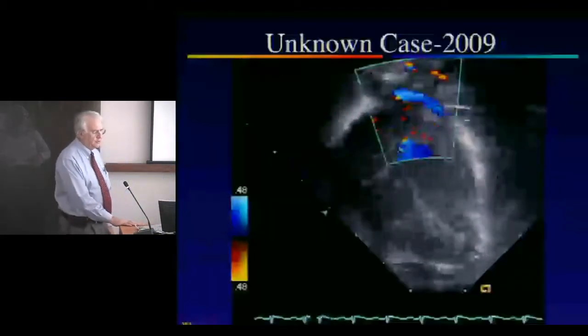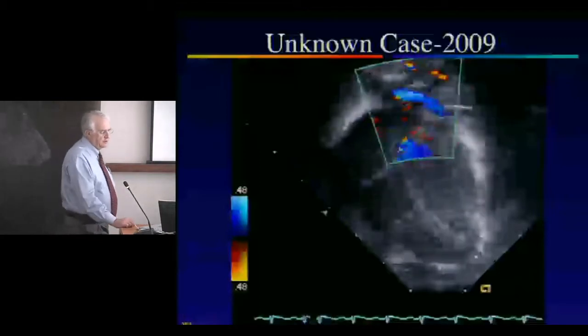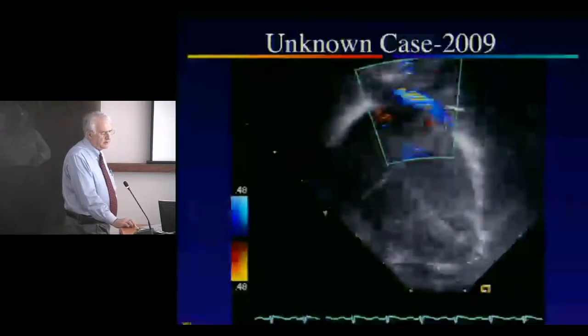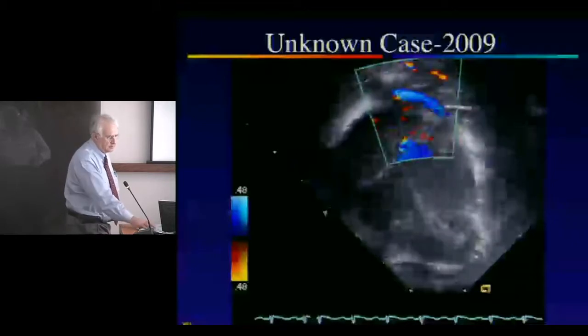Okay, and here's the echocardiogram from the 4-chamber view with color. So the ventricles look like they're pretty much okay for a neonate, and there's nice pulmonary blood flow, pulmonary venous blood flow, I should say. Nothing much happening at the atrial septum.